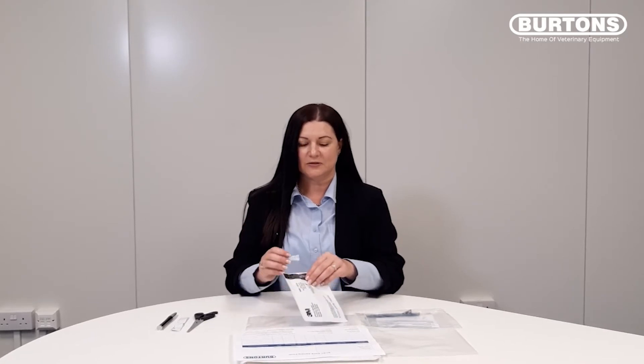Remove from the pouch the badge, placing the sachet back into the foil pouch. Put this to one side as you will need it later.